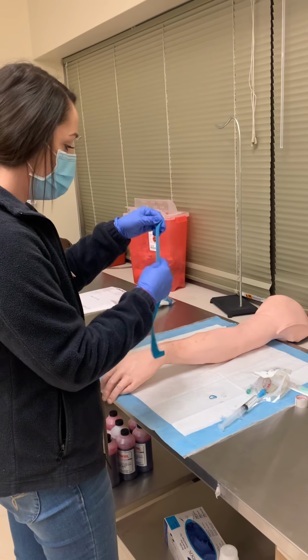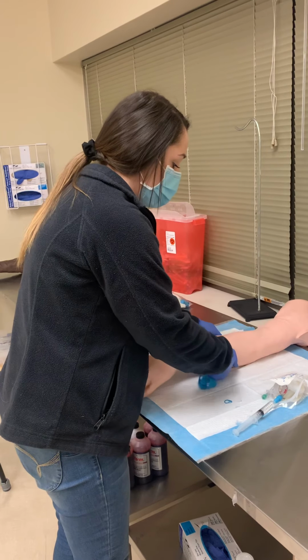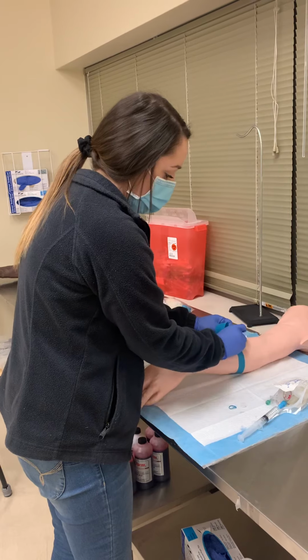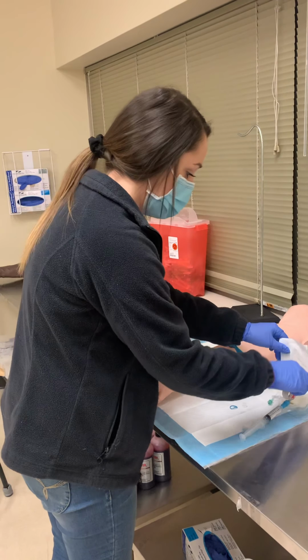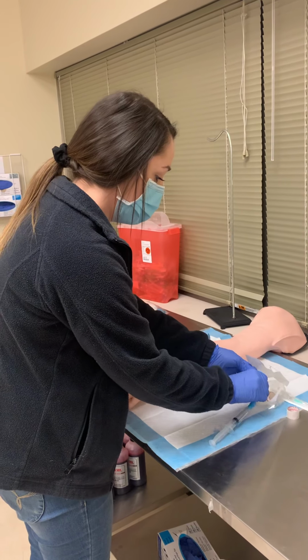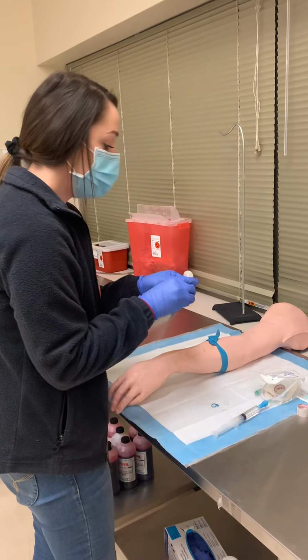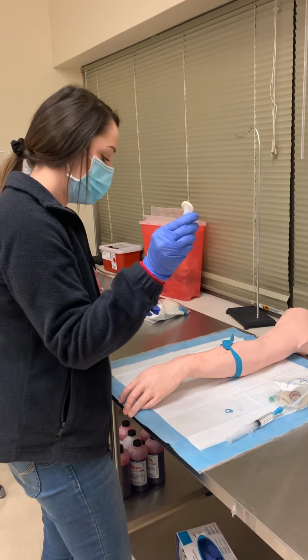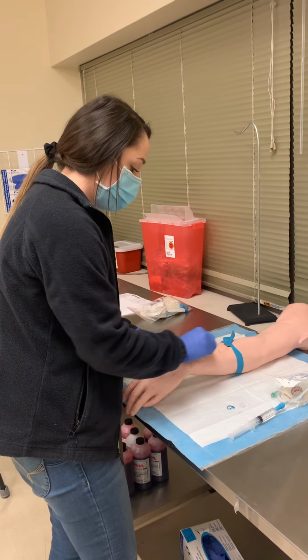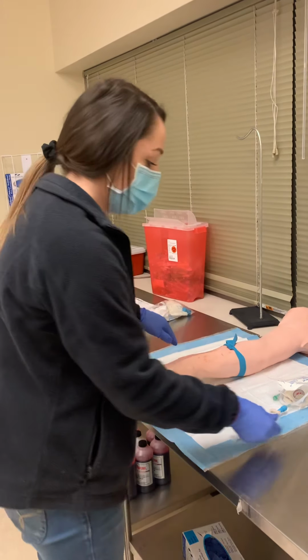I would apply the tourniquet 10 to 15 centimeters above where I'm going to insert. And then I'm going to use chlorhexidine in a vertical and horizontal direction and then in circular. Allow that to dry.